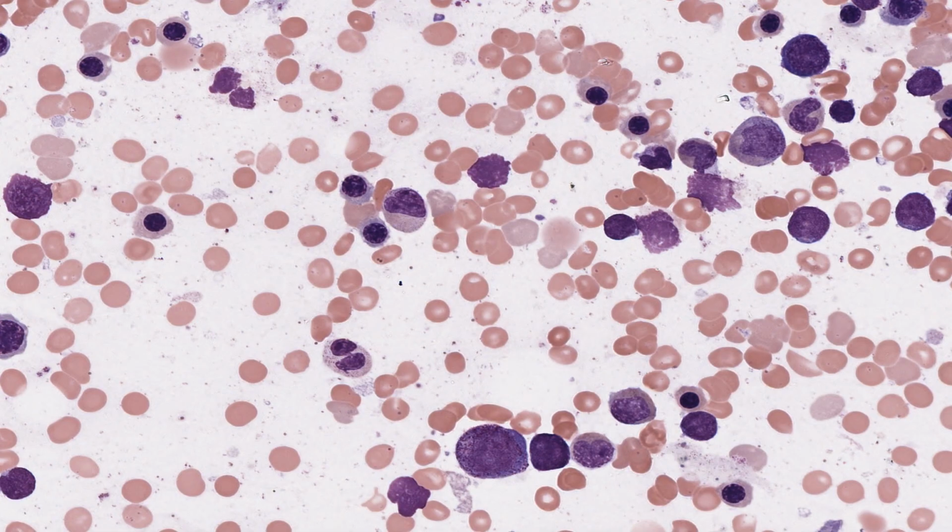normoblast you saw earlier, but because it has got a lot smaller, as I mentioned a moment ago, it has hemoglobin in it, which stains pink or reddish because it's a protein, but it also still has small traces of the protein factory and therefore traces of the blue stain. And that therefore gives the appearance of these cells as being polychromatic or a lilac colour. And finally, these erythrocytes are now fully mature and will be released into the circulation. They appear nice and rounded with a biconcave disc shape and now full of hemoglobin.